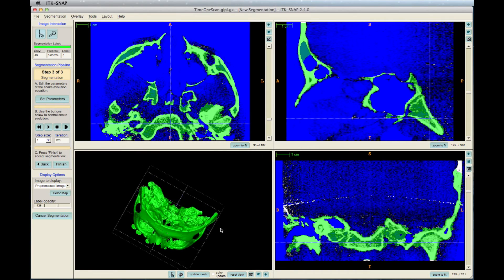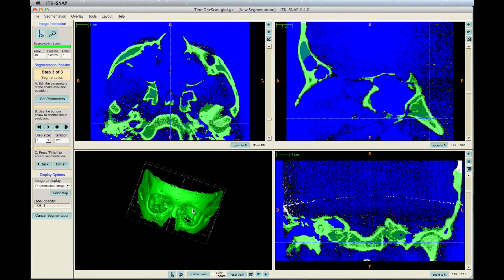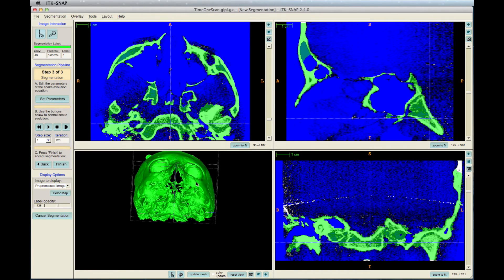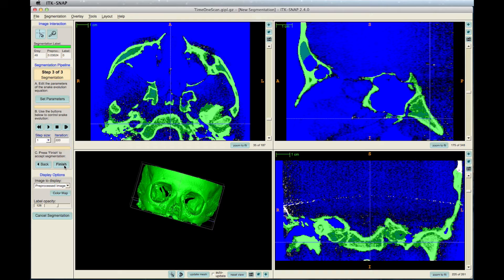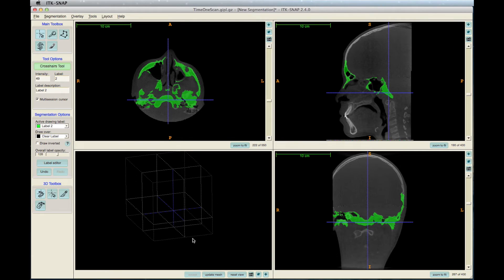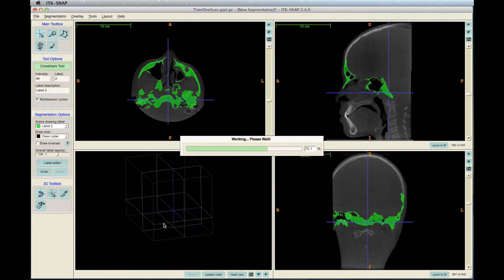When the segmentation is completed, click Finish. Click Update Mesh to see the final segmentation.